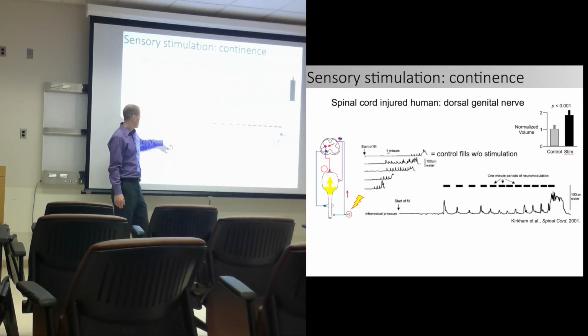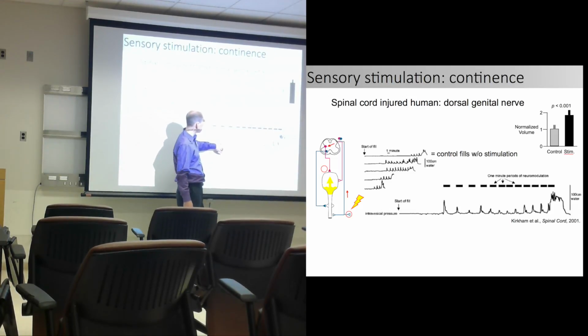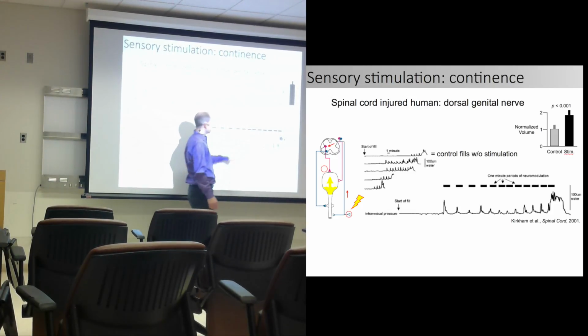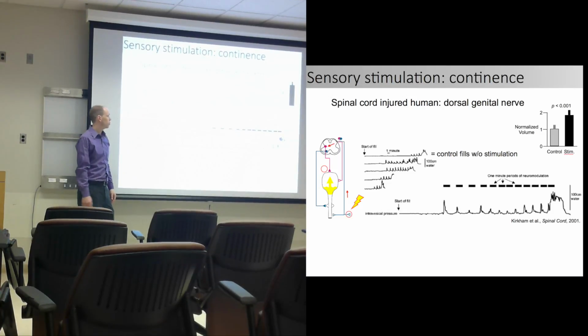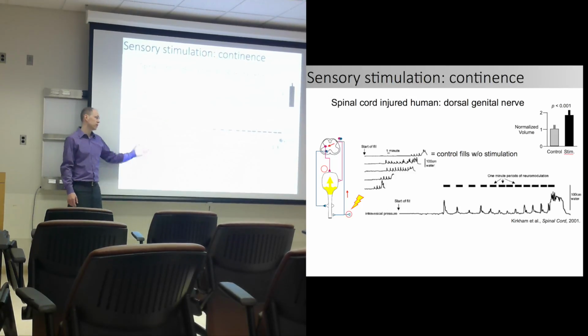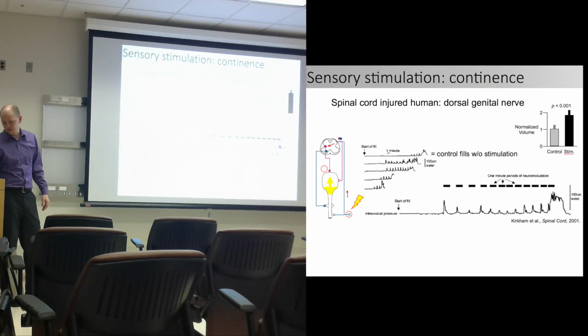And that's compared to some test trials in which, as the bladder is filled, anytime the pressure rose above a level, the stimulation is applied. And then it causes bladder relaxation until eventually the bladder is so large that there's leakage. What we effectively have is a stimulation bladder size compared to a control bladder size, and it generally leads to a larger effective bladder. But in this case, this determination of rising pressure is done under catheter in the urethra. Something that may work very well clinically isn't really practical for anybody outside of the testing scenario.